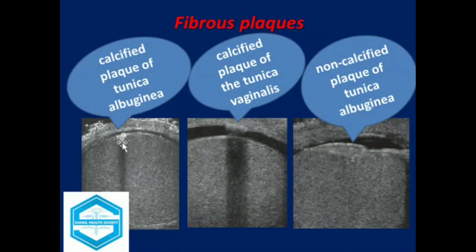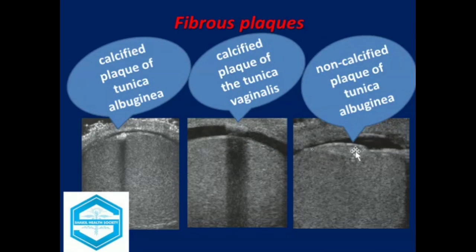This is the calcified plaque of the tunica albuginea, while this is the calcified plaque of the tunica vaginalis. This is a non-calcified plaque of the tunica albuginea.